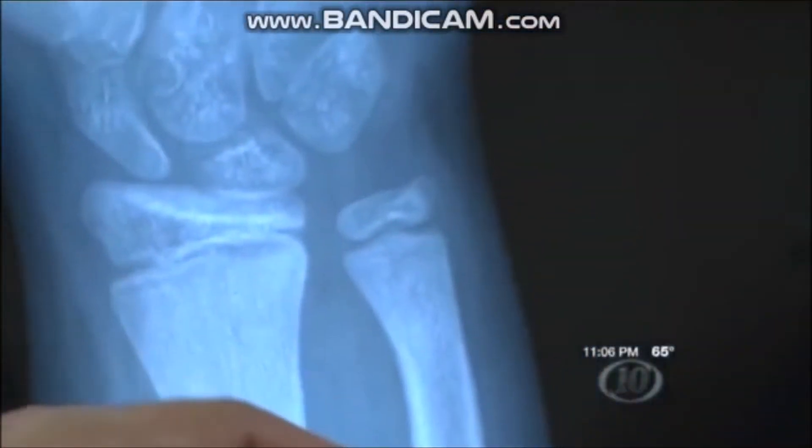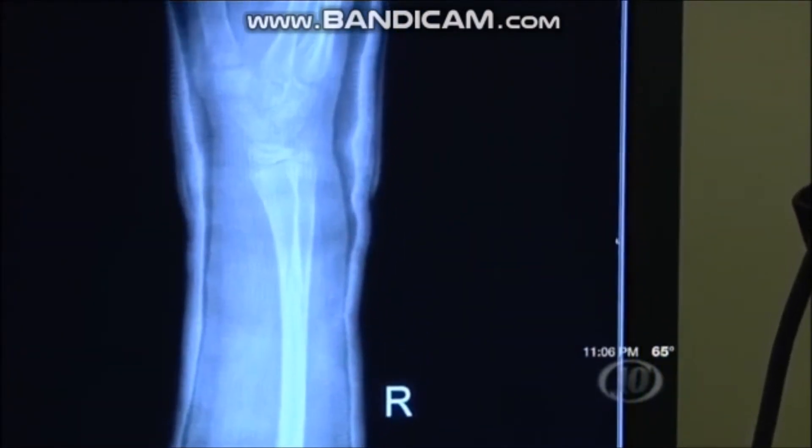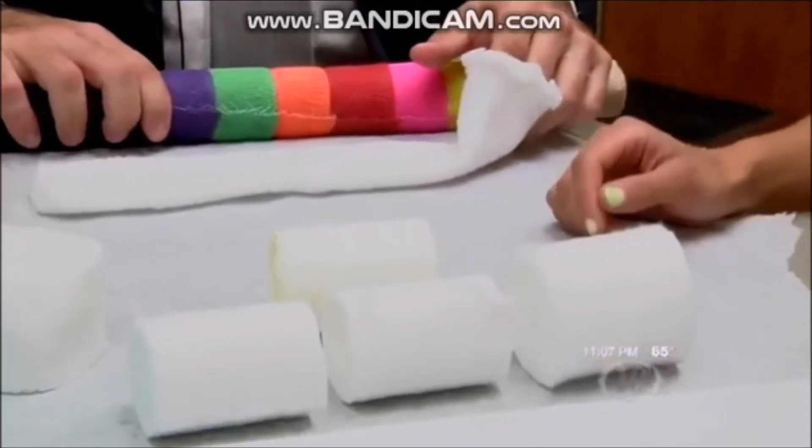This cast is only used for certain minor fractures that can heal quickly. Because of that, Osteofix is often the go-to cast for children. The children like it a lot more — it's a lot less bulky, and they can get in the water pretty much right away and not have to worry about mold, fungus, and things of that nature.